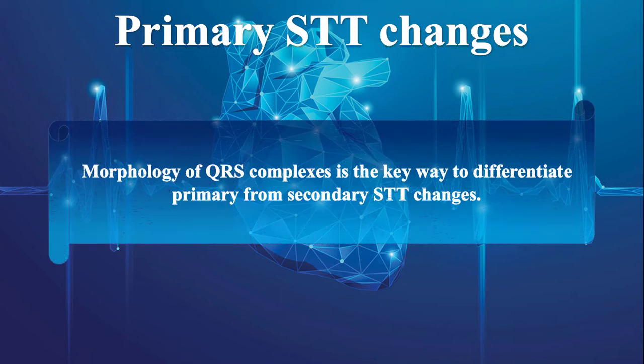In summary, morphology of QRS complexes is the key way to differentiating primary from secondary STT changes. Wide or tall QRS complexes with discordant STT changes favors the secondary type, while any STT changes in presence of normal QRS complex is the so-called primary type.